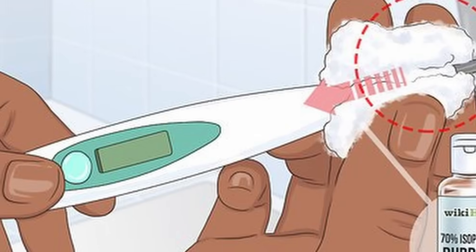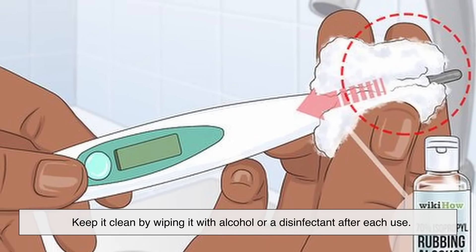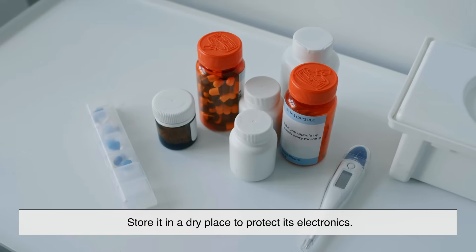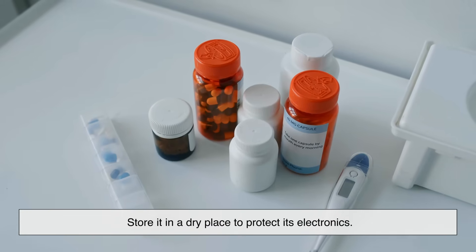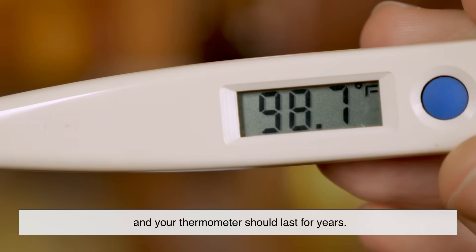Maintenance is simple. Keep it clean by wiping it with alcohol or a disinfectant after each use. Store it in a dry place to protect its electronics. Replace the battery when needed, and your thermometer should last for years.